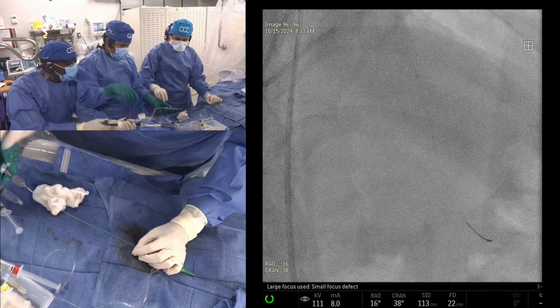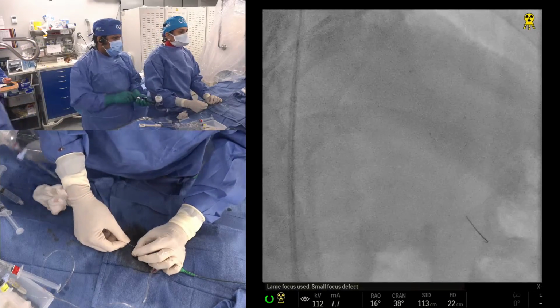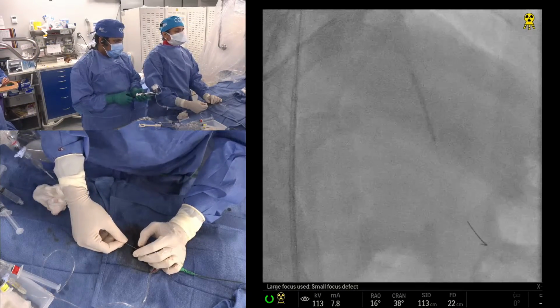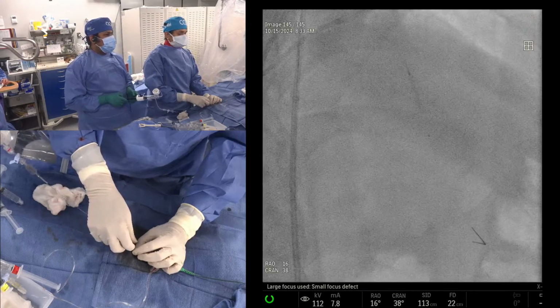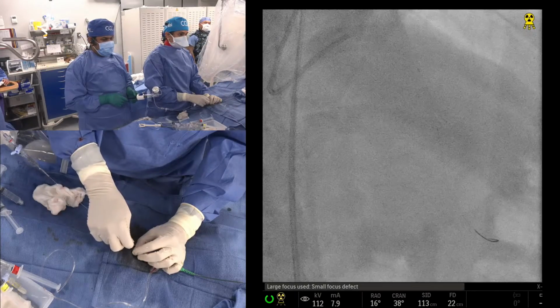This is how live cases should be: uninterrupted, high quality, three cameras. There is one from the ceiling demonstrating Dr. Kinney's finger movements, then a frontal and a side view, all exceptional imaging. We are very happy with them.